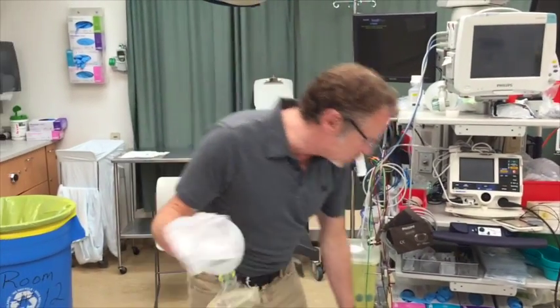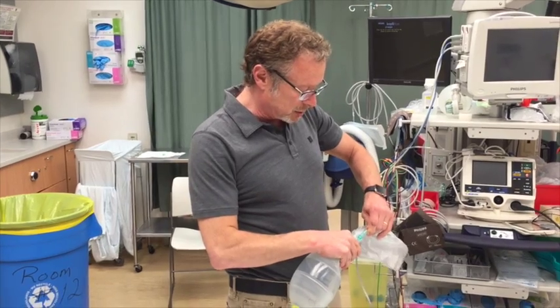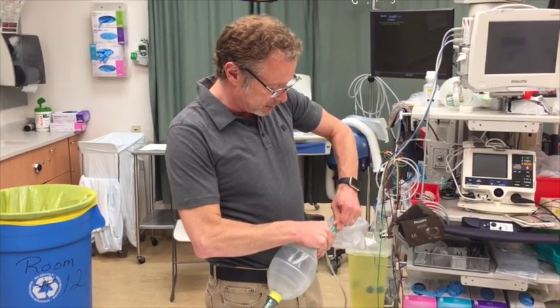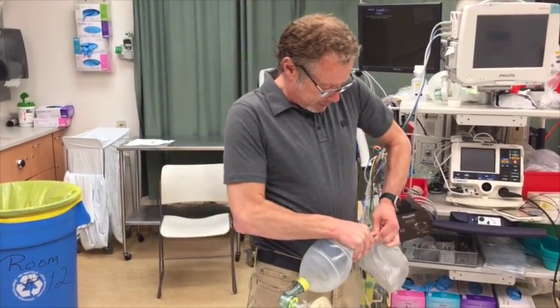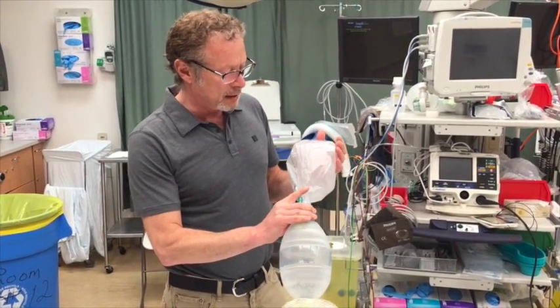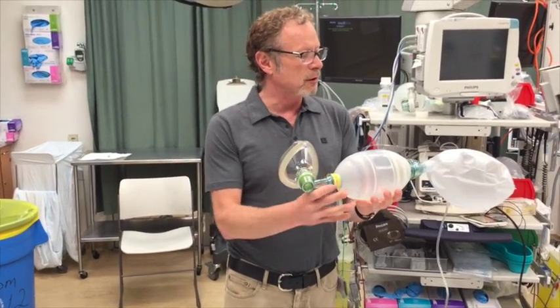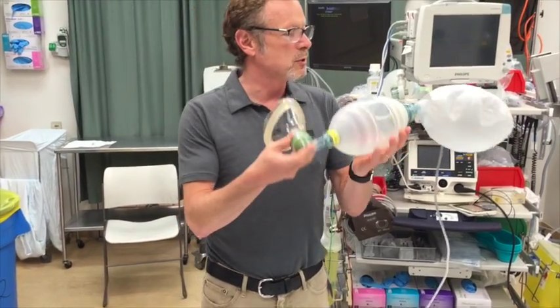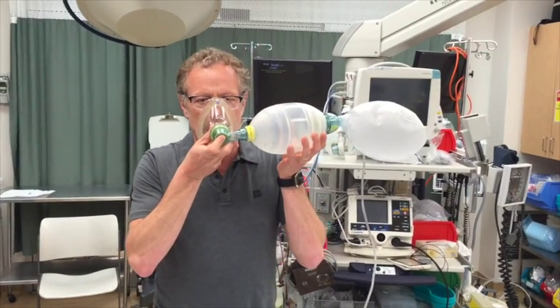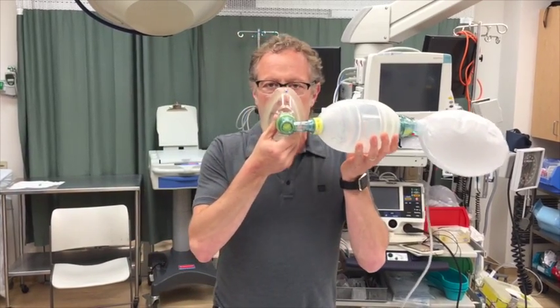This is currently hooked up to 15 liters per minute. When I hook this up you'll see the bag inflate, and then I'm going to put it on my face and breathe normal tidal volume breaths. As you can see, if you look closely you'll see the duck bill valve open.